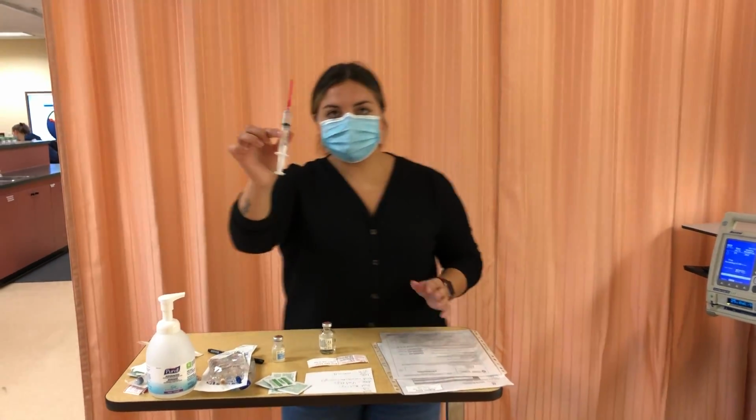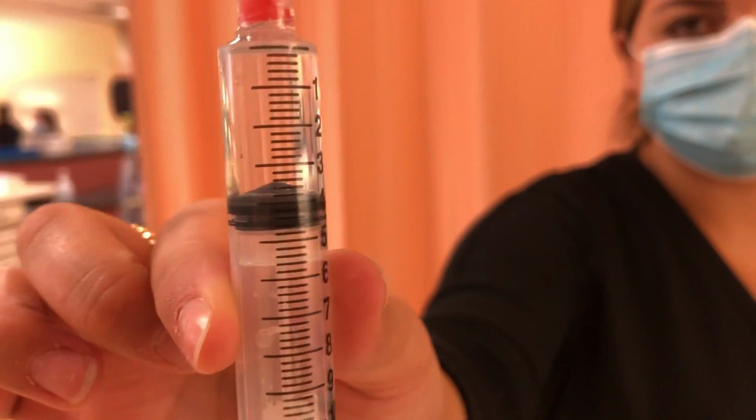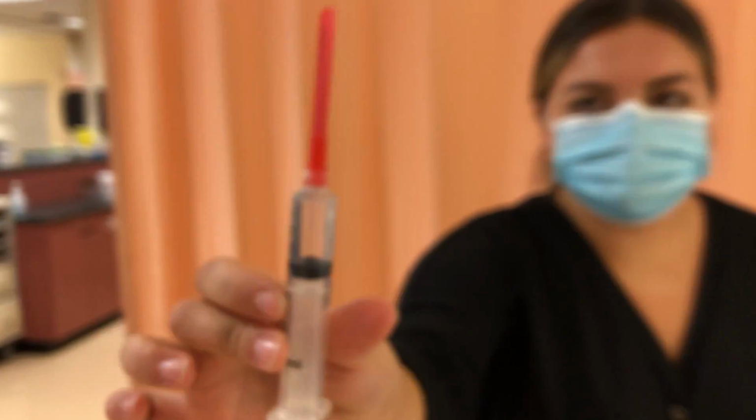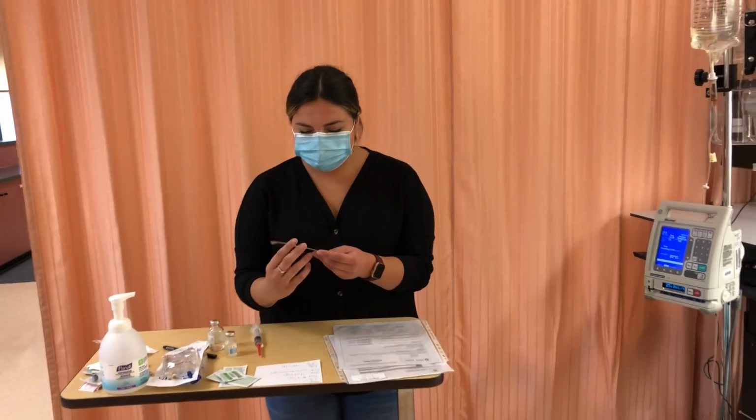Great, so I have 4 milliliters of medication. My needle is primed. No bubbles. So I've created a med label.